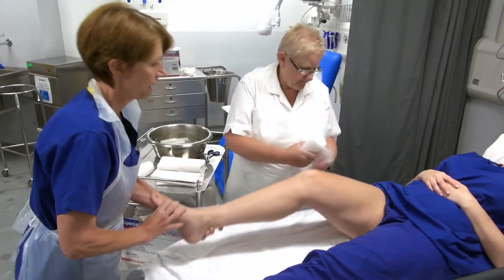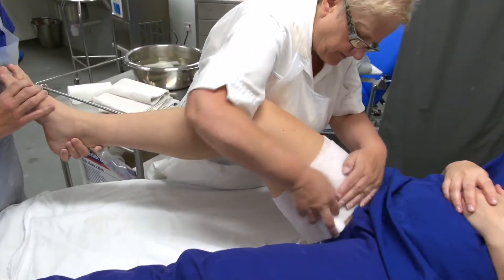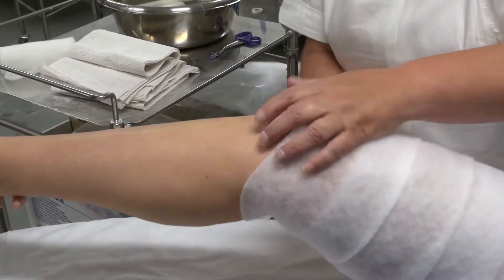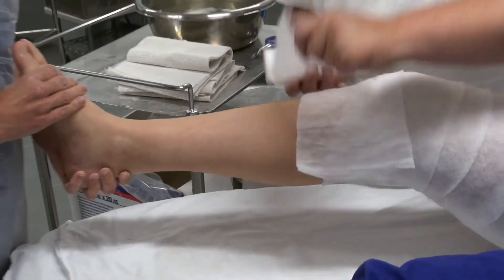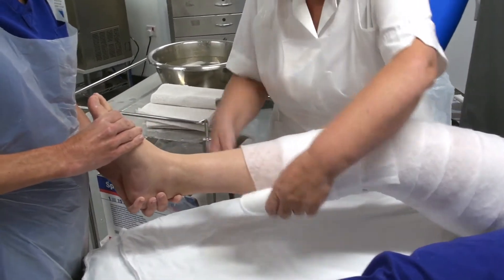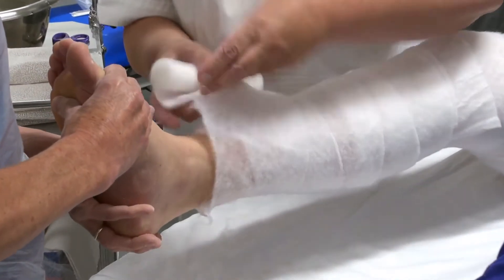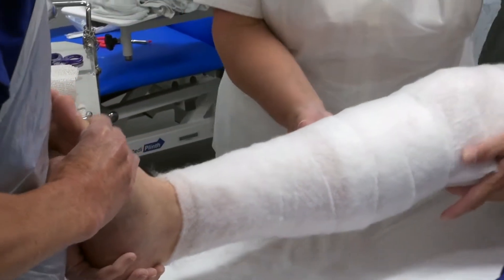I'm going to lift your leg up while Pam puts the padding on. I'm going to start at the top allowing for a turn back at the top. You need to keep the knee in just a natural flexion, so about five degrees. Padding goes all the way down to the ankle, allowing for a turn back.